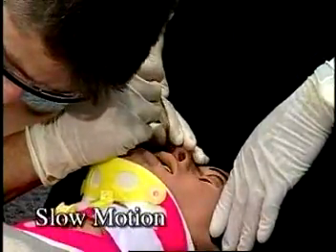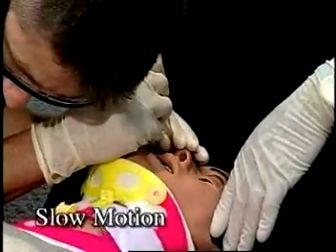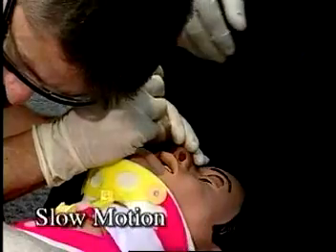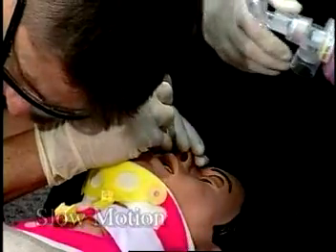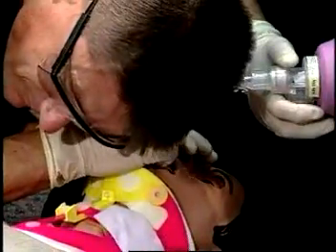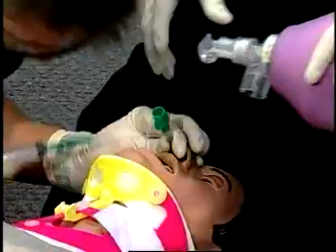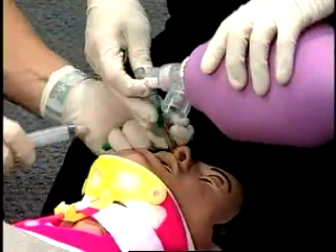The distal end of the tube should now be lined up with the opening of the vocal cords. Gently advance the tube into the patient's trachea while the patient is inhaling.